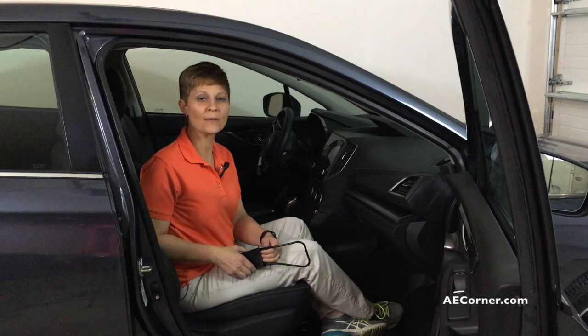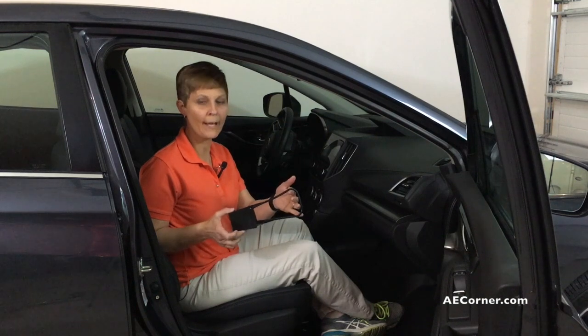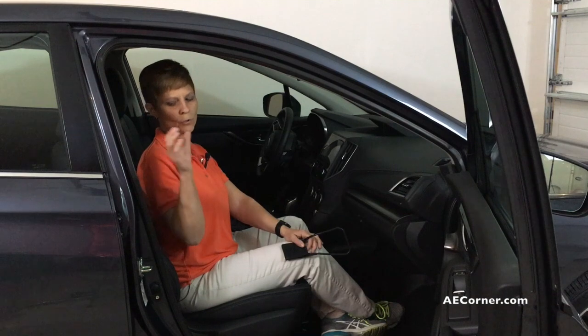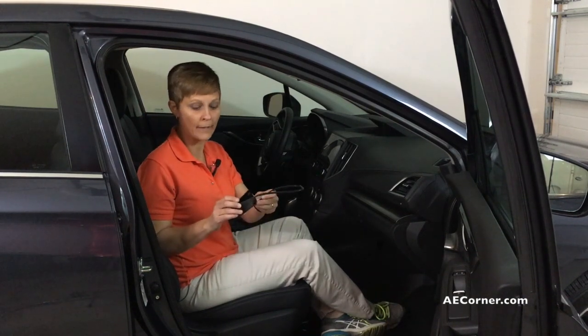Hi, Cindy here, physical therapist with Adaptive Equipment Corner. Today we are talking about what is called a seat belt grabber handle, and that's what I've got here in my hands right now. This is kind of an extension for the seat belt, especially if you don't have the range of motion of your arm when you're sitting in the car to reach back and grab your seat belt. This would come in handy.